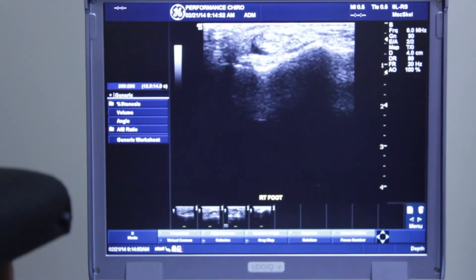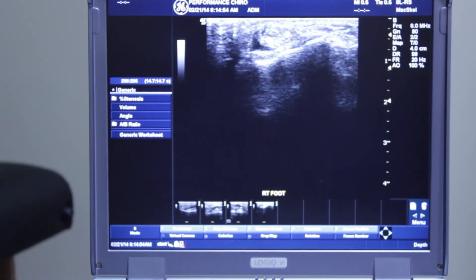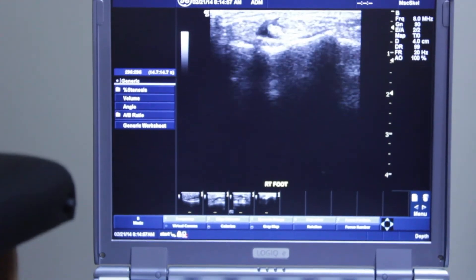But if I go just a tiny bit distally, you can see the black inflammation — that's the swelling and thickening of the peroneus longus and brevis.